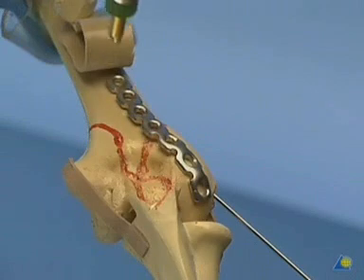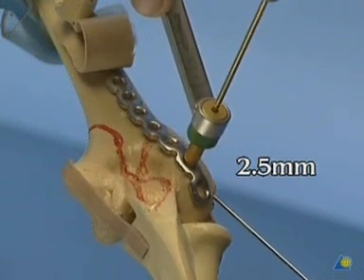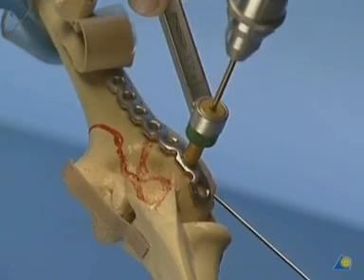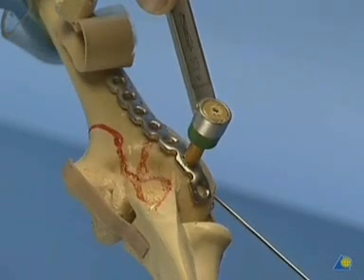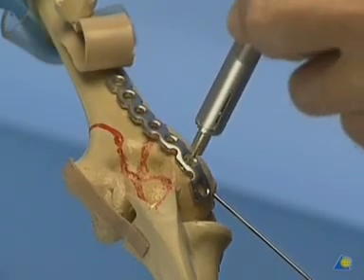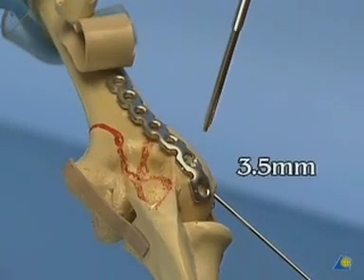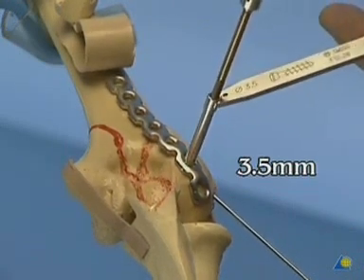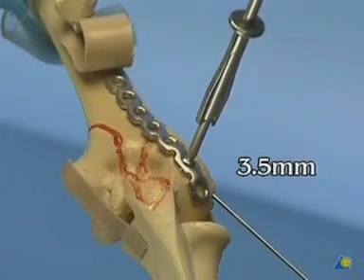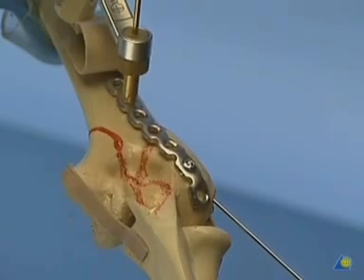The first 2.5 millimeter hole is drilled in the capitellum. The length of the hole is measured with the depth gauge. After tapping, the screw is inserted. The second screw is placed in an eccentric position in the humerus shaft fragment.